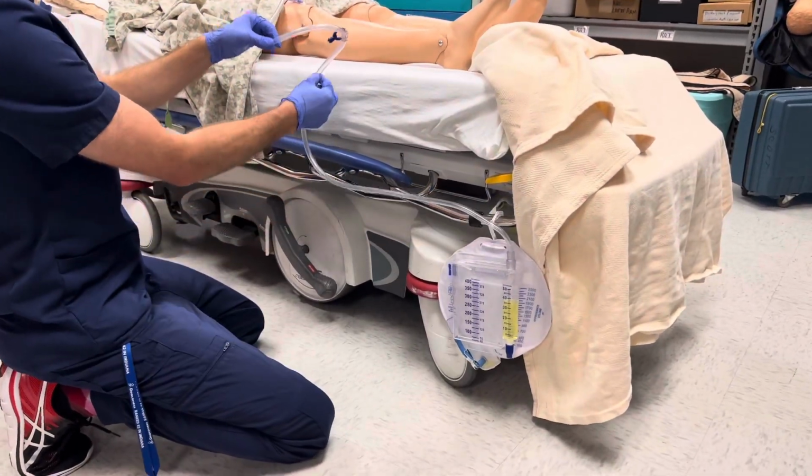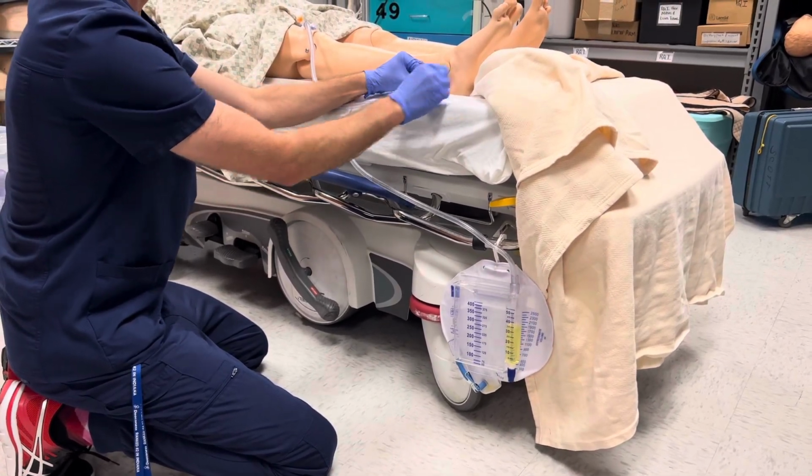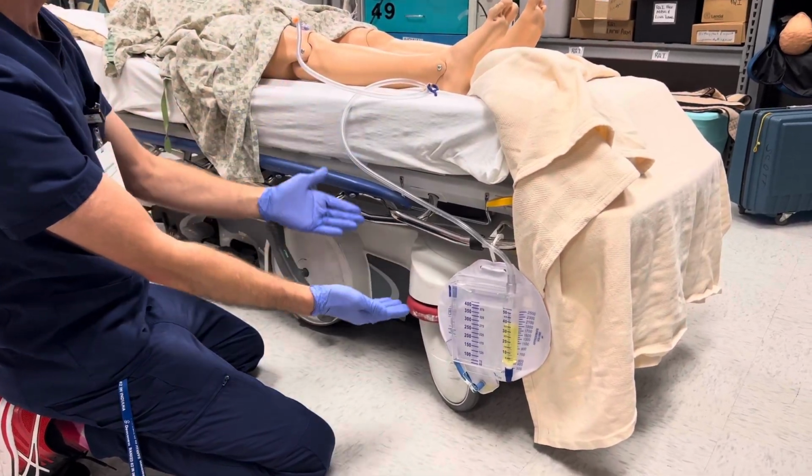You can accomplish this by using the sheeting clip. Make a loop of drainage tubing on the bed and then attach the sheeting clip to the sheets. This will allow gravity drainage from the bladder to the drainage bag.